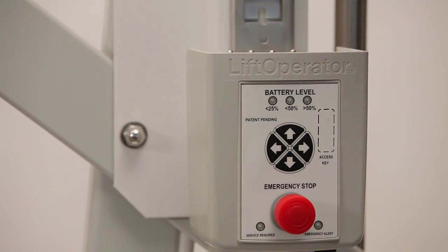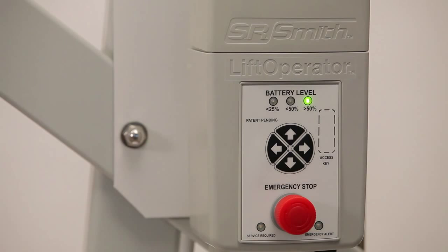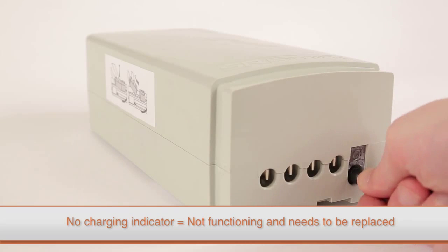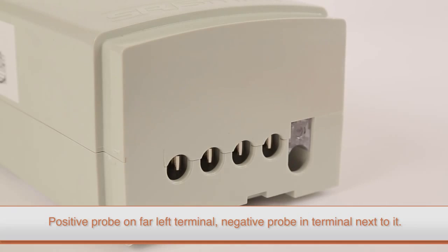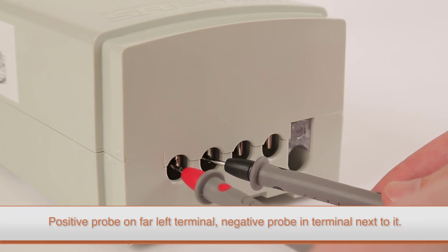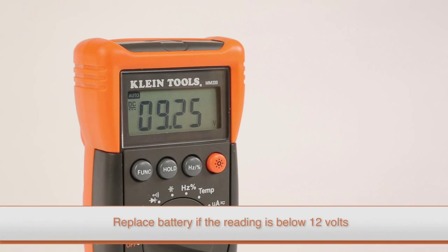If the battery pack has been discharged too low, or if the battery pack has not been charging for a long period of time, it may have been damaged and require replacement. Should this be the case, the indicator LED may not illuminate at all. Use a multimeter to test the battery by placing the positive probe on the far left terminal and the negative probe on the terminal directly next to it. Any reading below 12 volts will indicate that the battery pack has discharged too much and needs to be replaced.